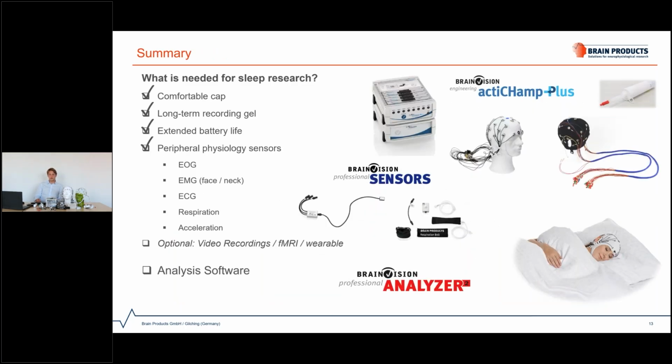So we have also checked this box, and it's now time for me to hand over to Bastian. All right. So thanks again for this nice introduction and overview about the hardware solution that we have for sleep research.